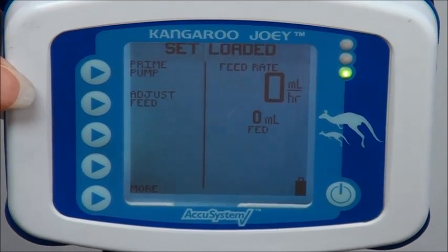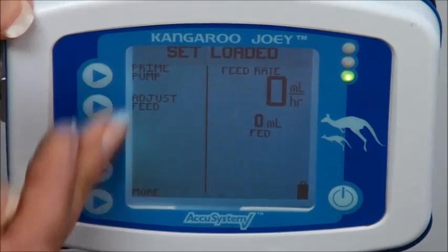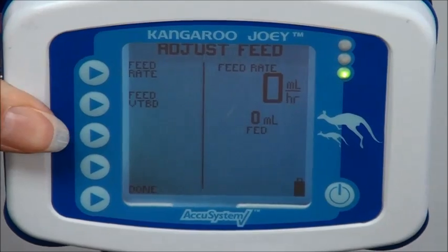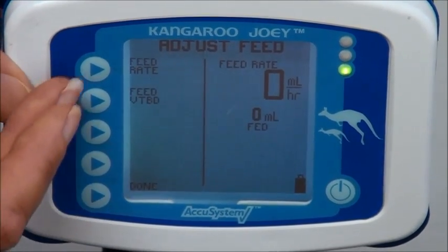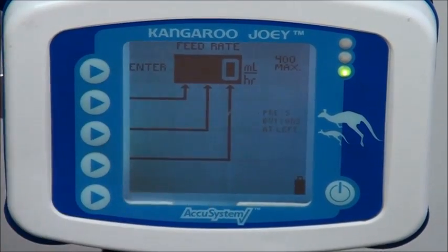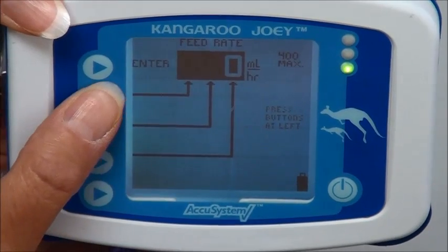So the next thing we're going to do is adjust feed. So I'm going to push the arrow button next to adjust feed and then two options are going to come up: feed rate and then feed to be delivered. So first we're going to put our rate in and I'm going to push the button next to where it says feed rate and it's going to come up with a screen that's going to let me put some numbers in. So you're going to put whatever number has been prescribed by your physician. For today I'm just going to put in some numbers.